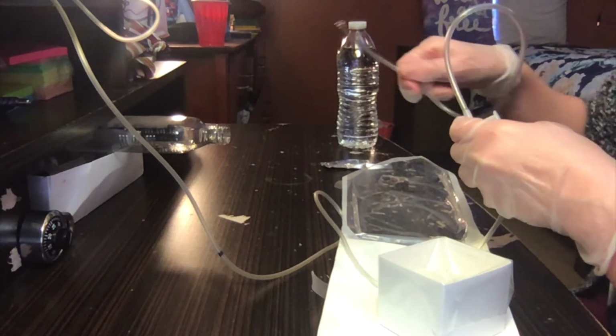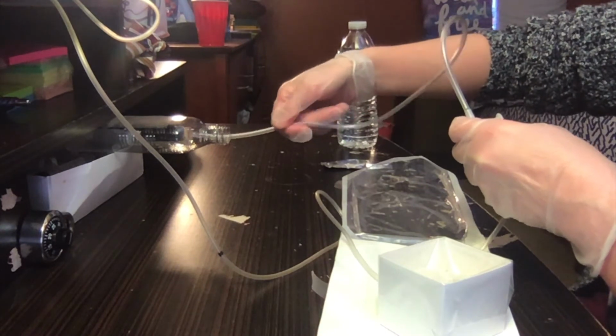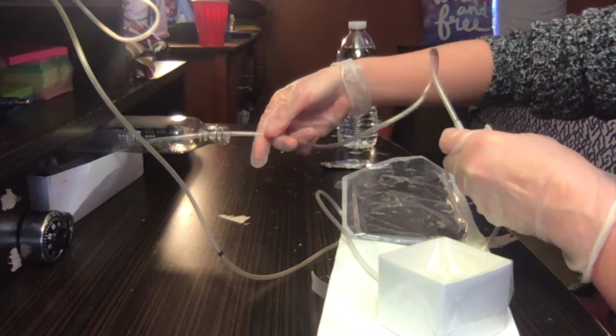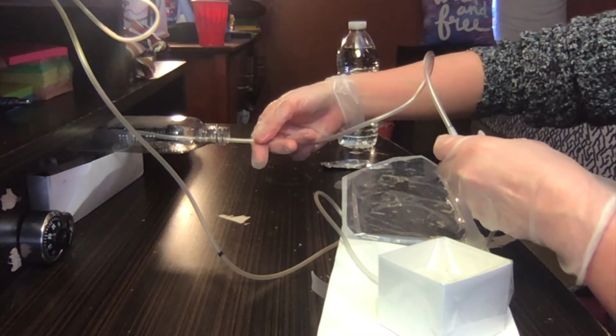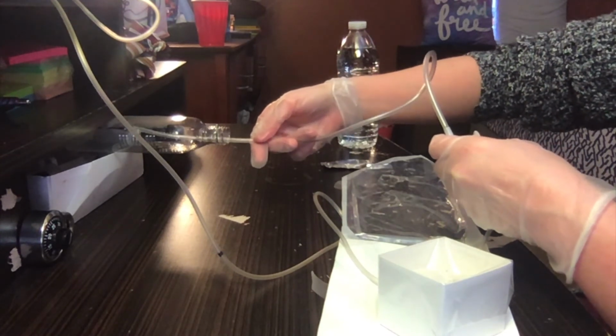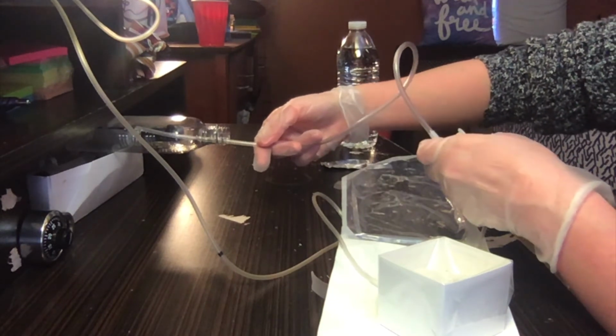Next, I'm going to gently insert the catheter into the nares, and you don't want to force it. You want to move along the floor of the nostril towards the trachea and roll the catheter between your fingers to advance if necessary. You're going to advance the catheter into the nares at least 5 to 6 inches to reach the pharynx. And you don't want to apply suction as you insert the catheter.